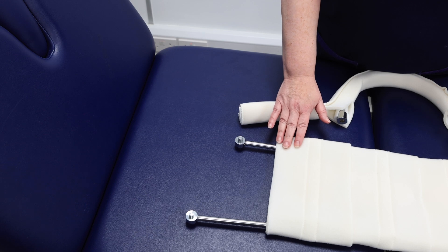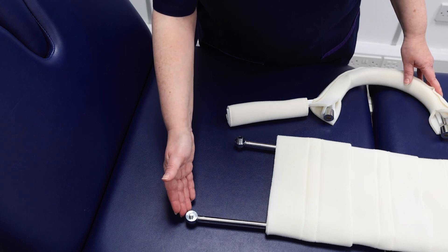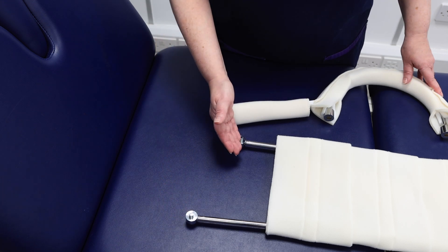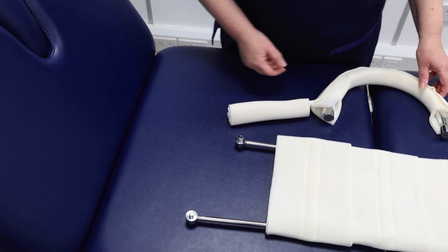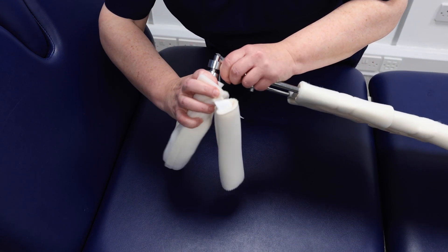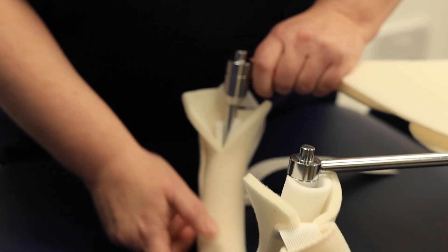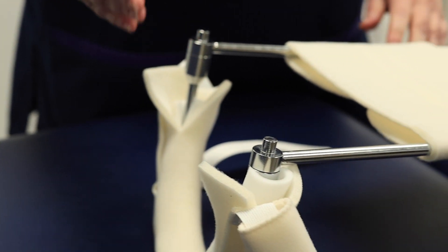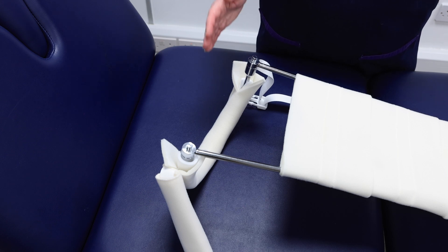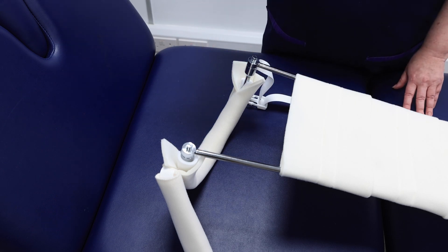Attach the prepared thigh hoop to the splint. Since the patient has a right leg fracture, the lateral aspect of the splint should be higher than the medial. When attached, the hoop should sit diagonally. This positioning is crucial, as the Thomas splint applies fixed point traction, anchoring against the patient's sit bone, while the other traction point comes from the skin traction.